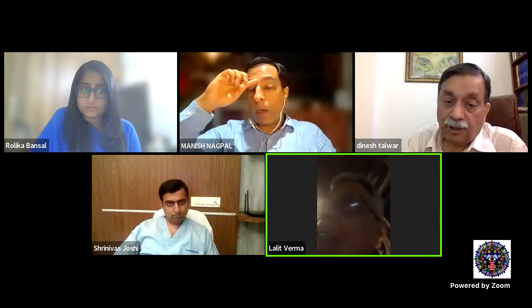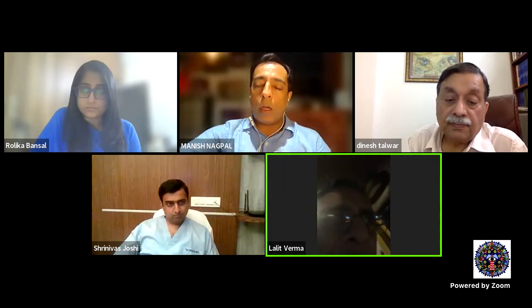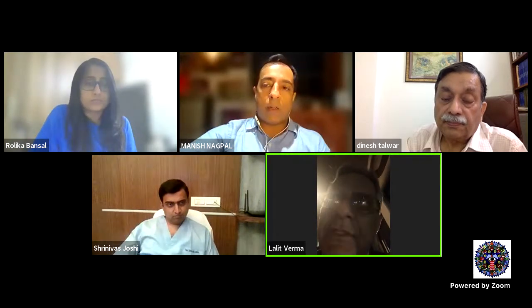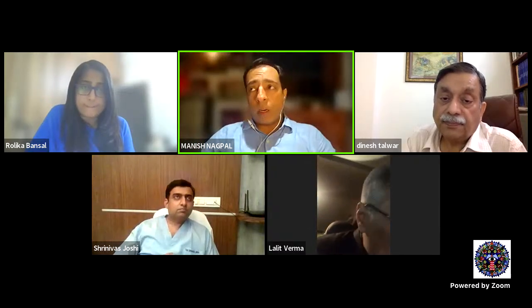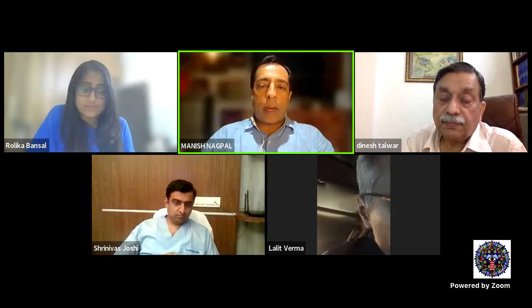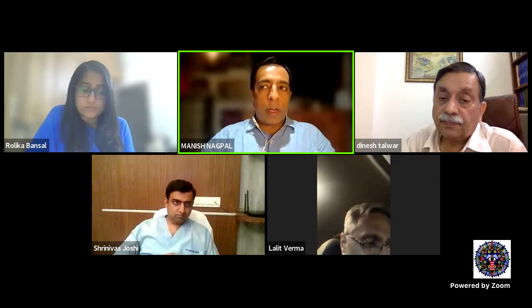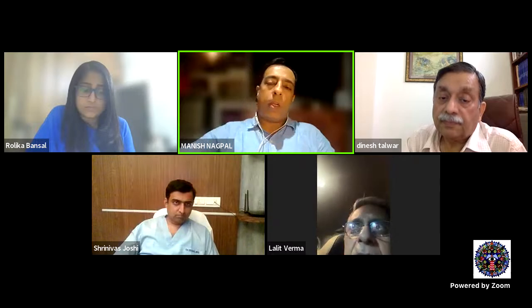I think the reason I asked this, Manish, is because, especially in high myopes, it's always that last bit of cortical vitreous. Yes. And it's always better to reconfirm, especially in high myopes, that even if a few crystals stick, that means there is some part of hyaloid. I agree. In fact, in high myopes, I would go to the extent of saying that even if you stain once for the hyaloid, maybe put a little bit a second time, because there is this sheet of cortical vitreous which fools you. You realize it when you are actually doing some peeling there, and it will not work the same way as you are used to seeing.